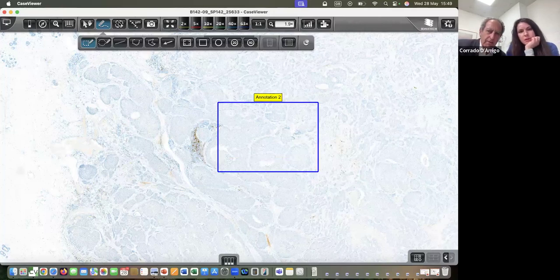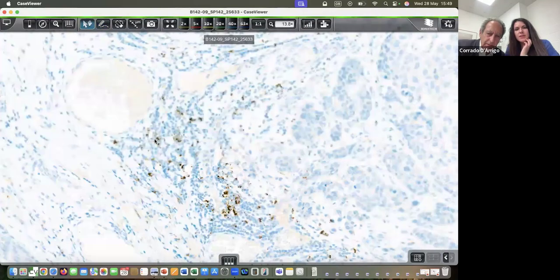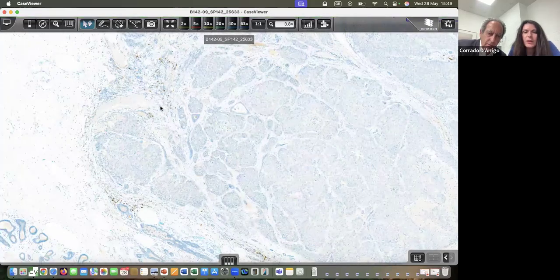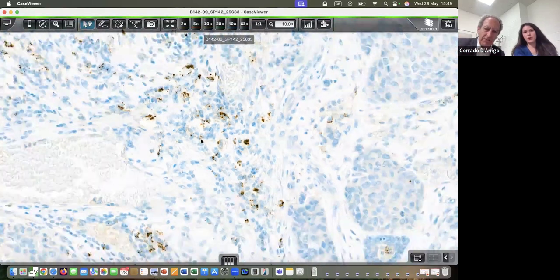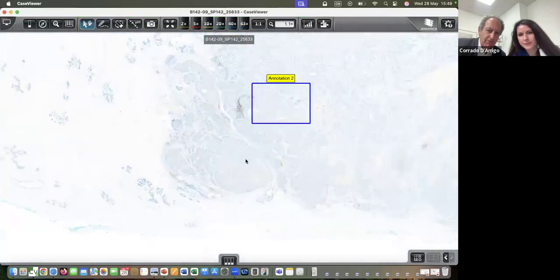Okay, very good. So all of these already fill a little bit. And then there is a little bit here that is quite significant. And then here, there is quite a lot more. And again, you need to remember, it's not the staining that you use to fill up, it's the whole cell. The size of the cell staining. You need to imagine the size of the cell there. So there is staining here. This is a difficult case.